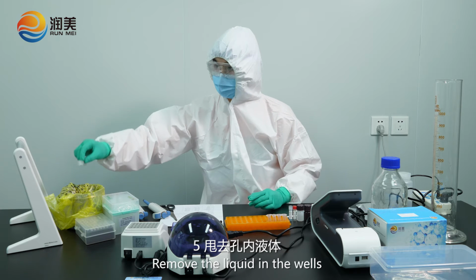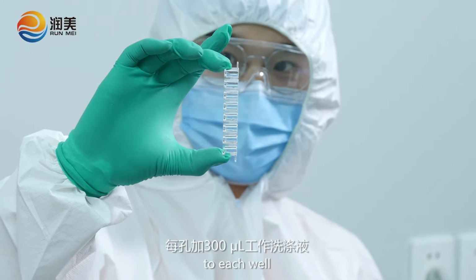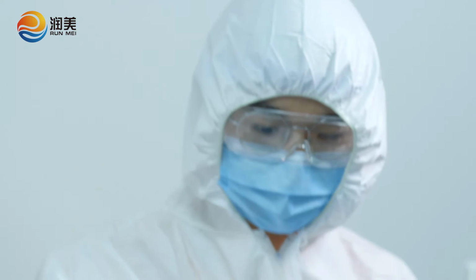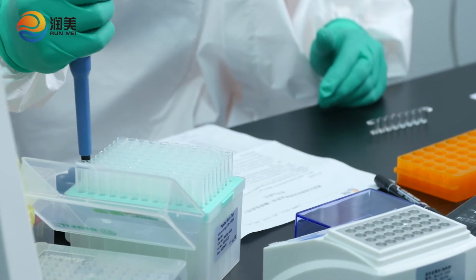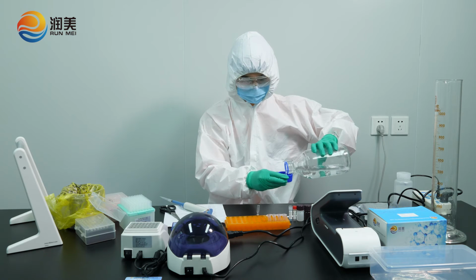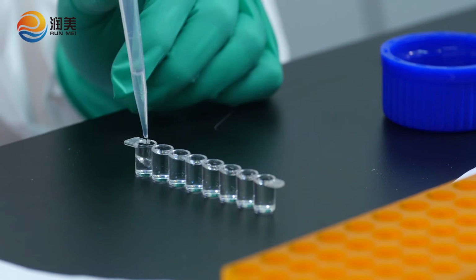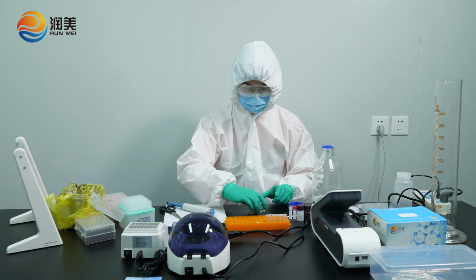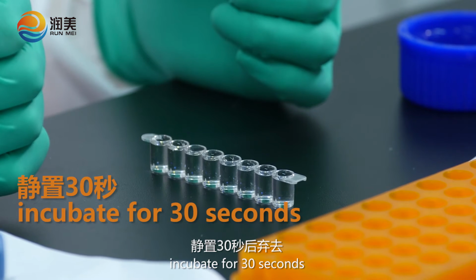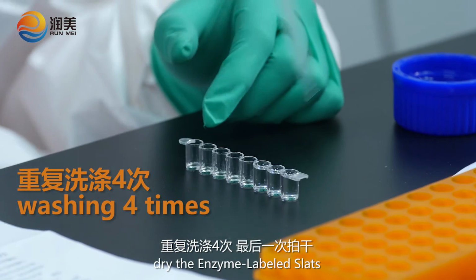Remove the liquid in the wells, then add 300 microliters of washing buffer to each well. Incubate for 30 seconds, then remove the liquid. After washing 4 times, dry the enzyme labeled plate.